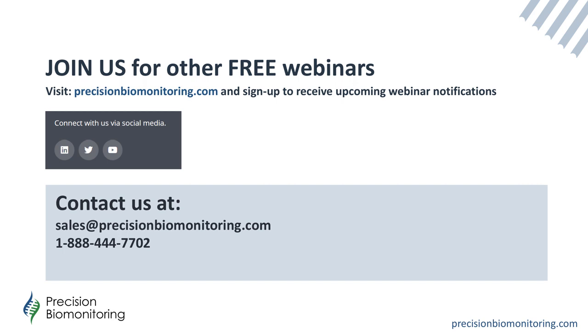Right. So we have not validated specifically in terms of clinical data in our Health Canada authorization or instructions for use specifically for asymptomatic screening. That said, as we have discussed through this webinar, RT-qPCR, real-time reverse transcription PCR, is really the gold standard for doing this kind of testing. And so it should be quite effective, as any other test would be for asymptomatic people, but we have not validated that claim.